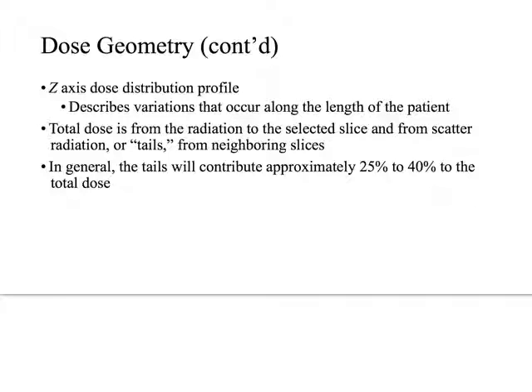There is also additionally, so that's kind of what we just talked about, was dose in that X and Y coordinate. There's also going to be funny things that happen with dose along the Z-axis, right? And so if you look again on page 167, it has it illustrated very nicely in that if we're traveling along the Z-axis, the radiation is going to kind of tail from one slice to the next. So what I've drawn here is the Z-axis. Let's say this is the slice that's defined by the collimator, right? The dose is actually going to do something like this, where it tails kind of from one slice to the next. So as I get more slices in here, we start to see this tailing effect overlap from one slice to the next, and we get these little hot spots where that tailing effect has created scatter radiation that's increased patient dose from slice to slice. So it is, again, not uniform along the Z-axis.